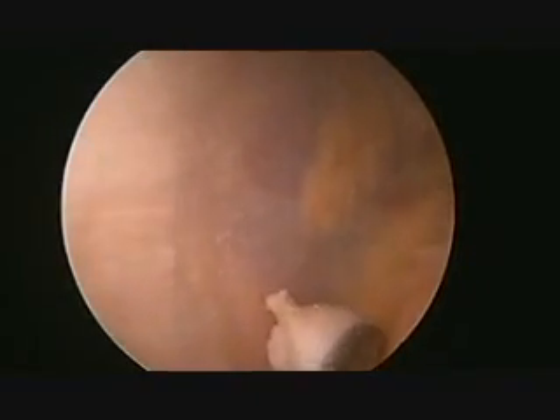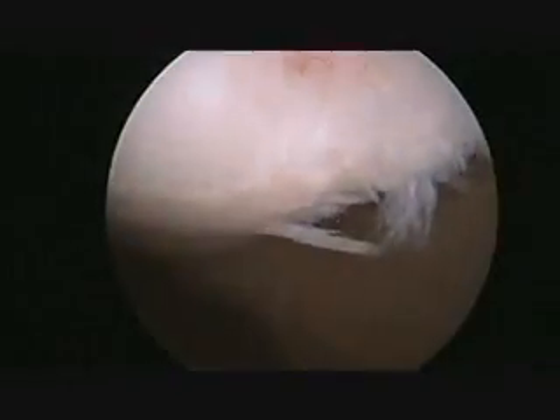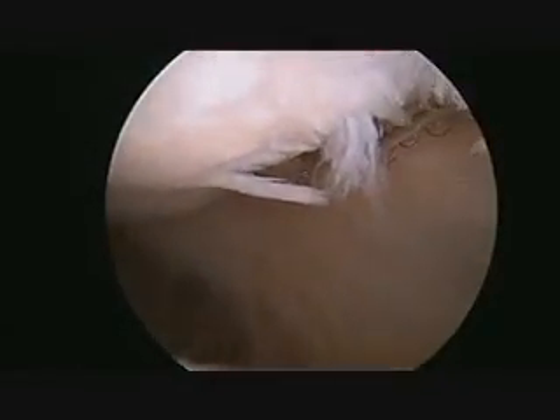The knee should be examined again to confirm no other loose bodies. Once all of the loose bodies have been removed, the examination of the knee continues to identify the source of the loose body.